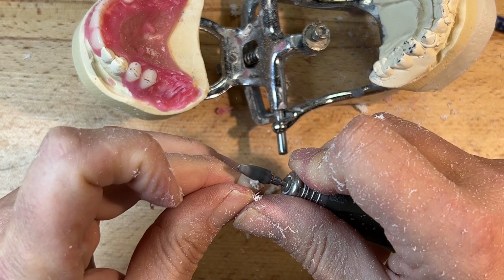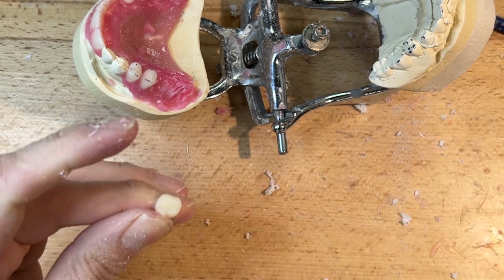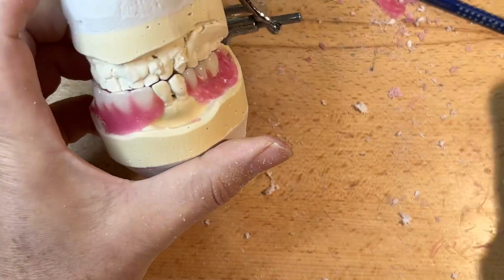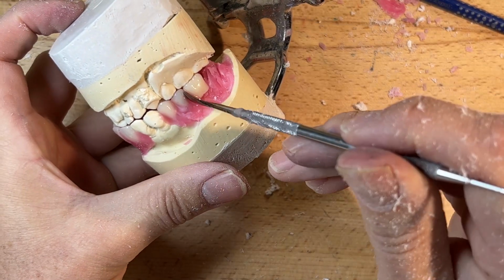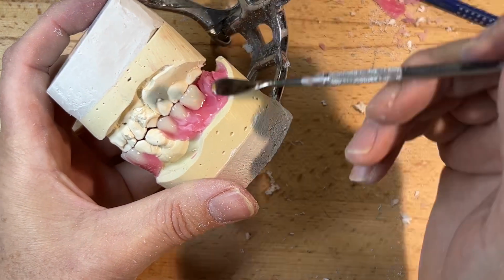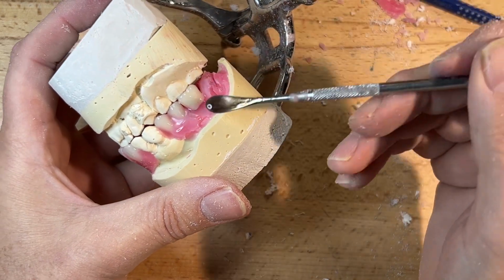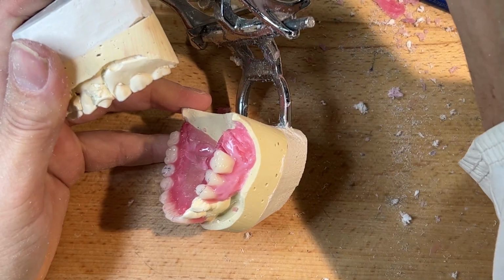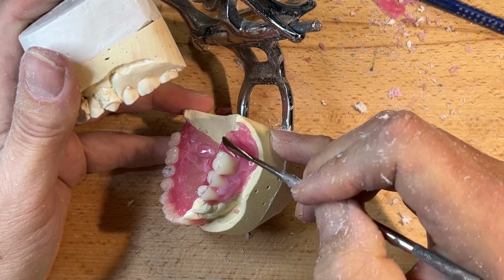So we need to kind of have the morphology going back to the cultural setups of our clients. We just can't go into the same mode all the time of molds, shades, and arrangements. If we can change the arrangements to best suit the patient, what they look like, if you want to use some cultural stereotypes in your setup, that's fine. I think that's obviously overlooked too.